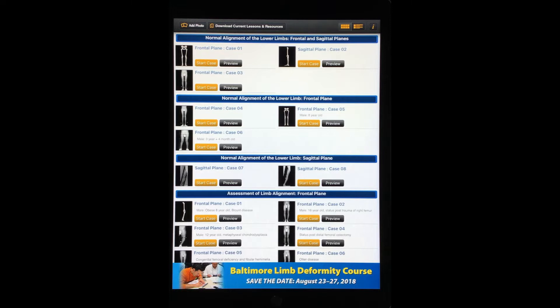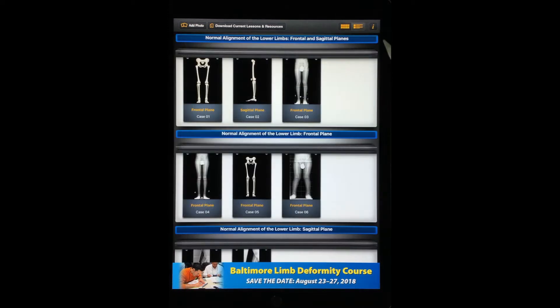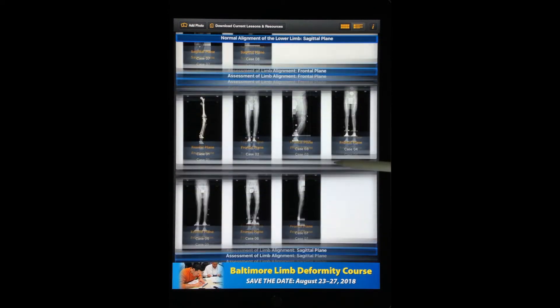On the main menu page, the cases may be displayed in two different ways, either in a list or in a graphic format.